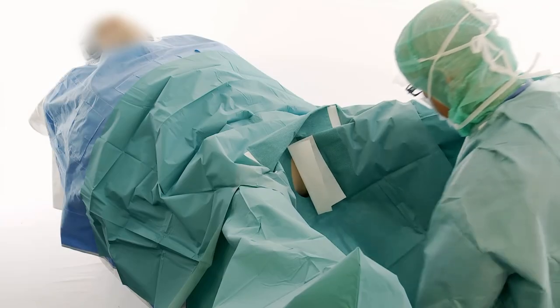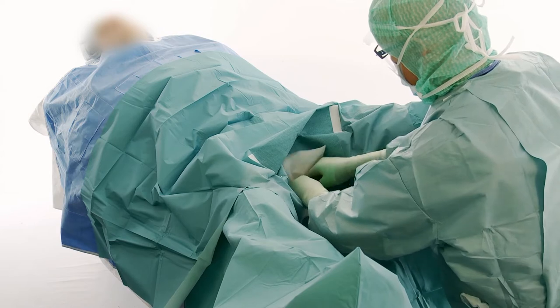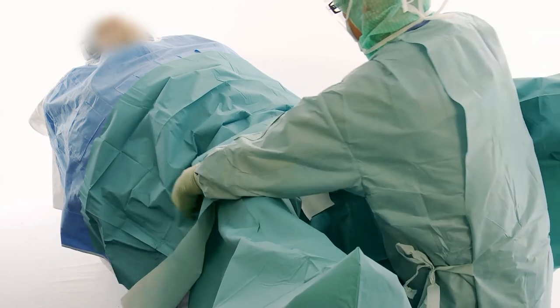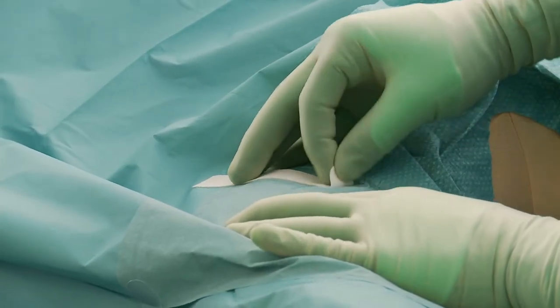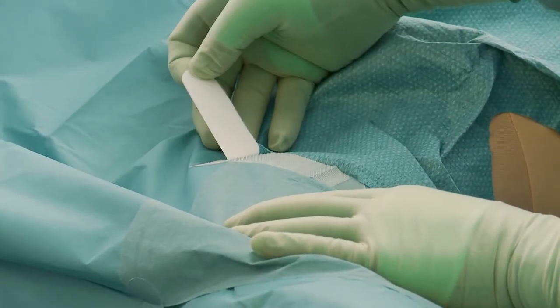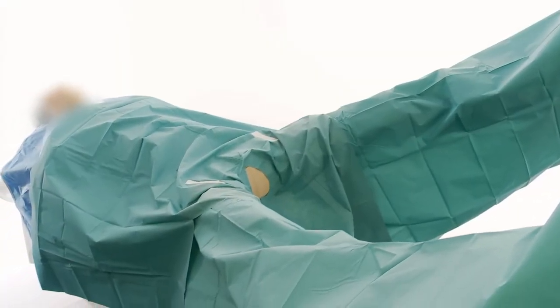Ensure that the adhesive film is securely attached to the patient and remove the crepe paper. Use the hook and loop for fixating tubings and cables. Draping is then completed.